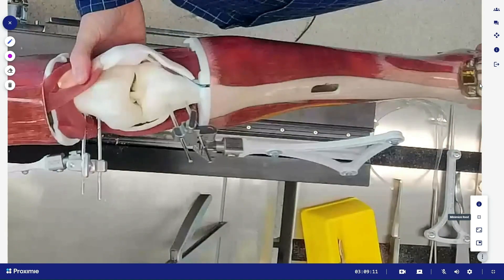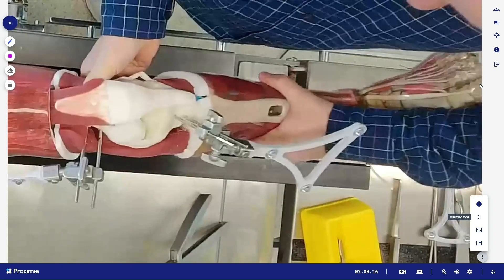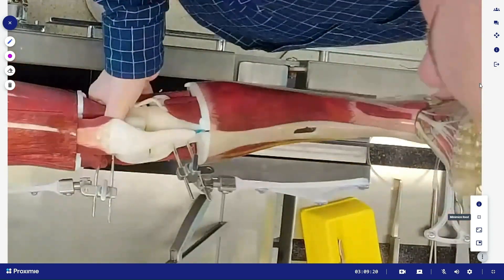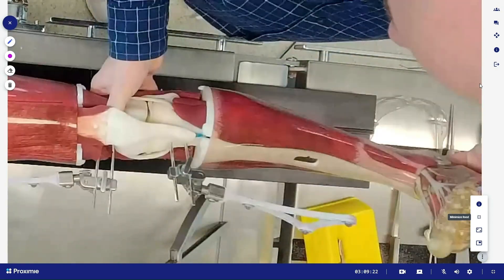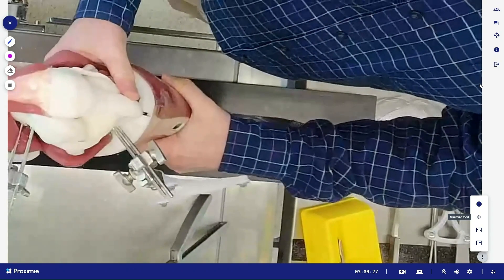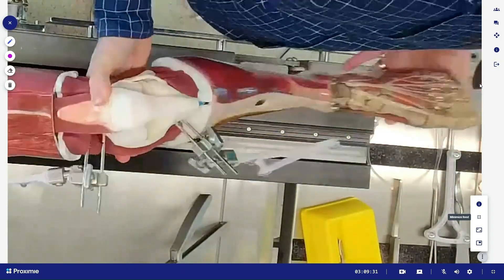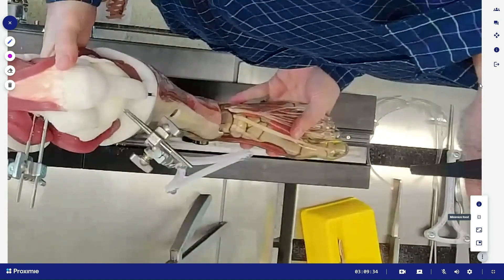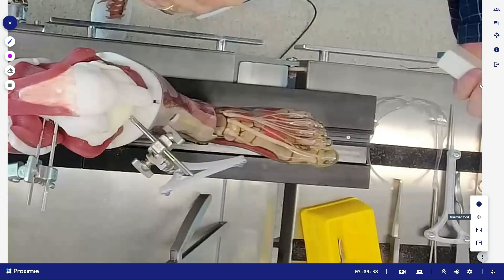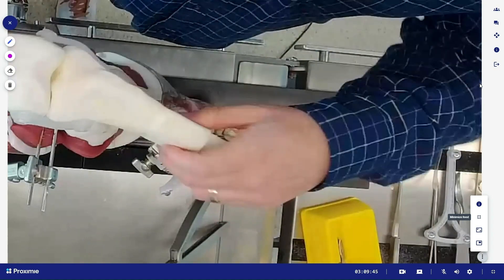As I bring this out straight and apply an AP draw and varus and valgus stress, it moves and feels very much like a functioning knee with a hard endpoint to all those soft tissues. That's really critical. I just heard Andrew talk about having realistic soft tissue grafts and realistic ligaments — and until now, this has kind of been the gold standard outside of cadaveric labs.